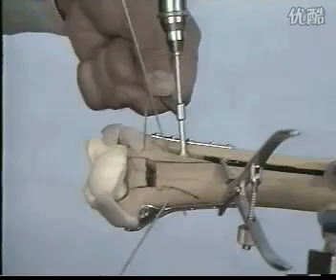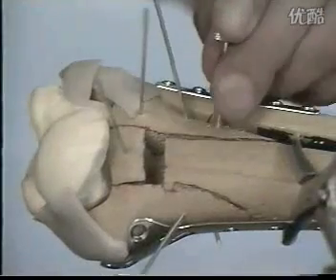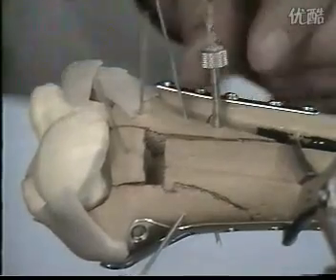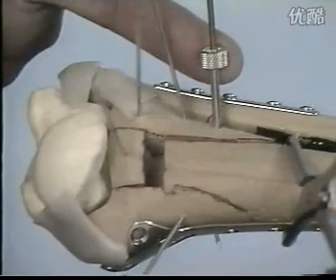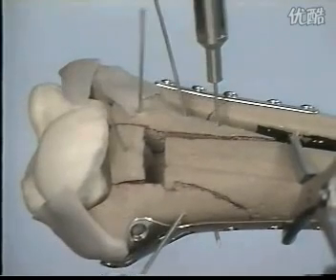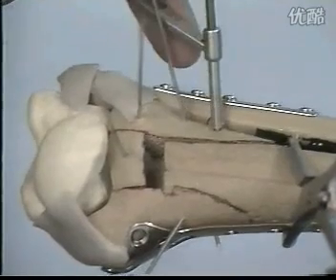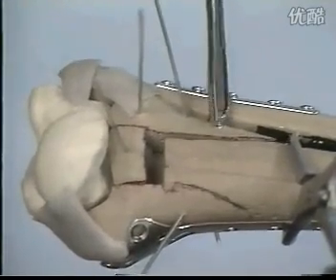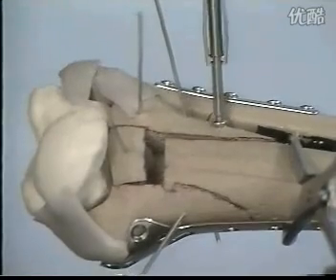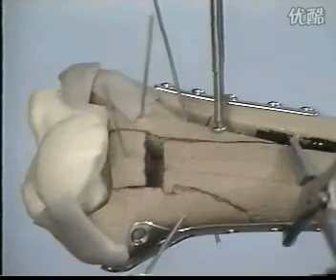In the shaft zone of the tibia, we use lag screws in the normal manner. When we tighten the lag screws, the fracture gap closes and thereby compresses the fragment to the tibial shaft.